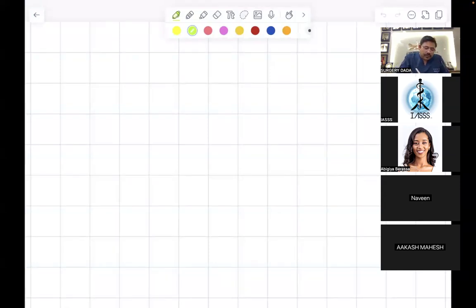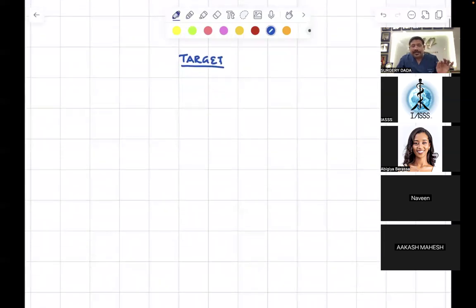There are three important rules in cholecystectomy or in any laparoscopic surgery. The first is the target. You need to lock the target. This is the same way as when you hire a shooter, a sniper, to shoot someone. First he has to lock the target, and only then can he do anything.